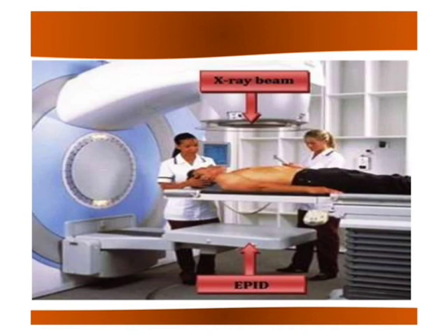The problem of moving structures, especially in the thorax and abdomen, is one of the concerns in radiotherapy planning and treatment delivery. It has been observed that a 1 centimeter movement can lead to a plus or minus 5% dose to the tumor area, and the movement depends upon how much the tumor shape and morphology change day to day, the interfractional, or during the radiation, the intrafractional. So it is very important to deal with the problem of tumor movement.